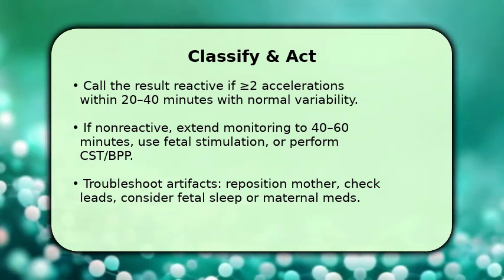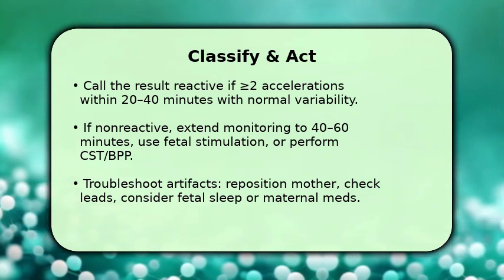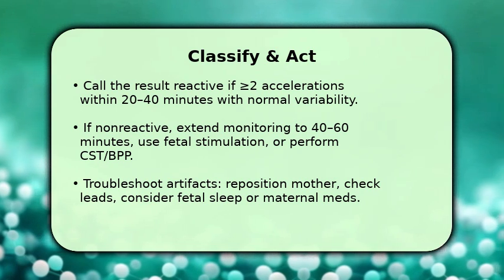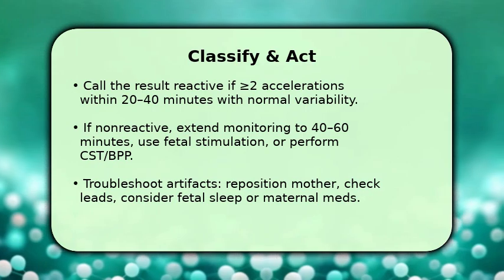Finally, if tracings look abnormal or noisy, troubleshoot quickly. Reposition the mother. Fix lead placement, and consider fetal sleep or maternal medications as common confounders before changing management.